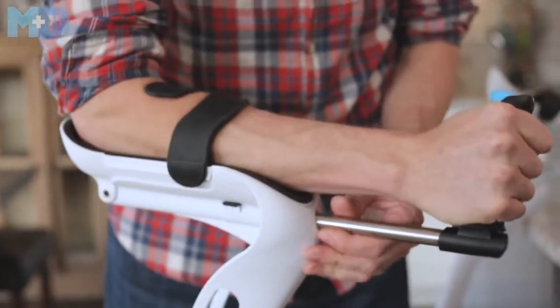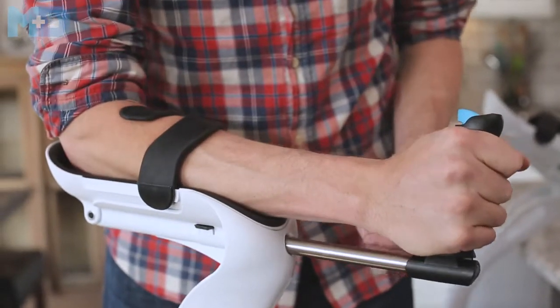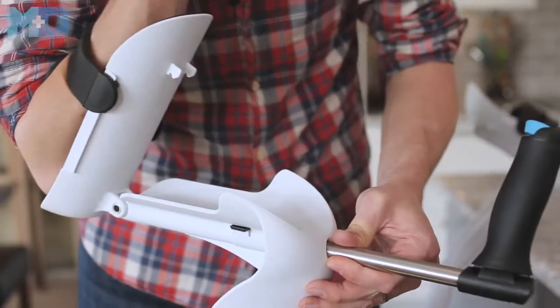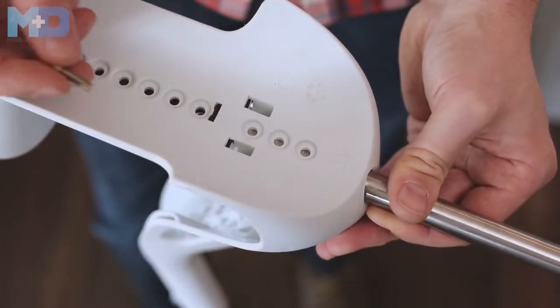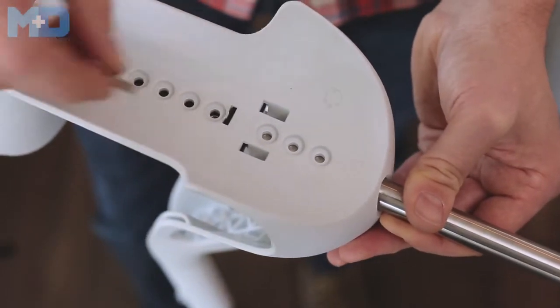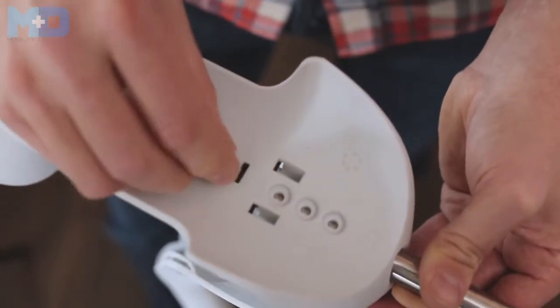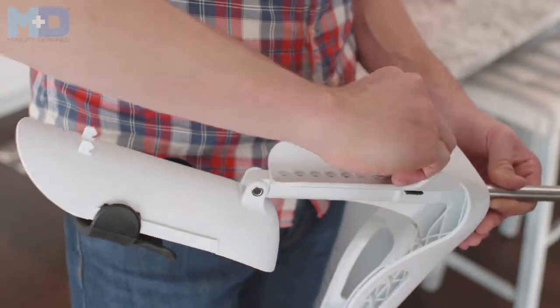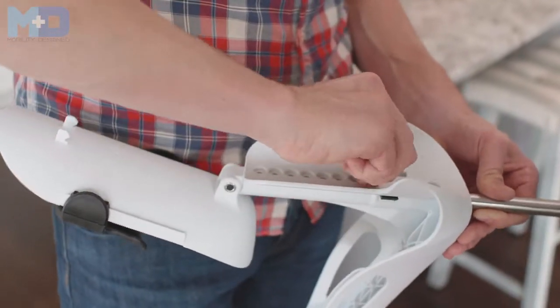When you feel like it's comfortable and not putting pressure on the inside of your palm, all you have to do is hold onto the handle and click up and see which hole aligns with your handle and your crutch. Then you can take your arm out of the cradle and insert the screw. Either use a coin or a screwdriver to tighten your handle until it is nice and snug.